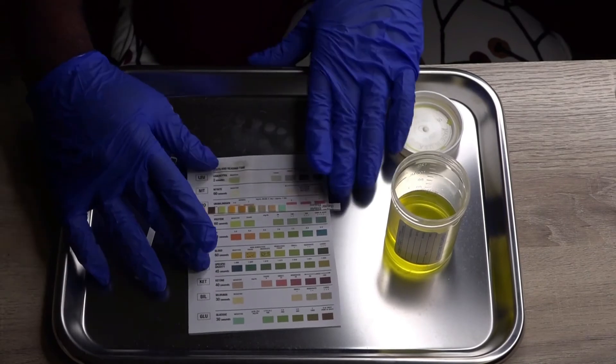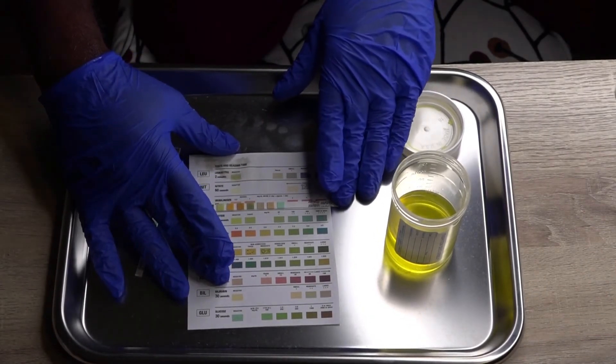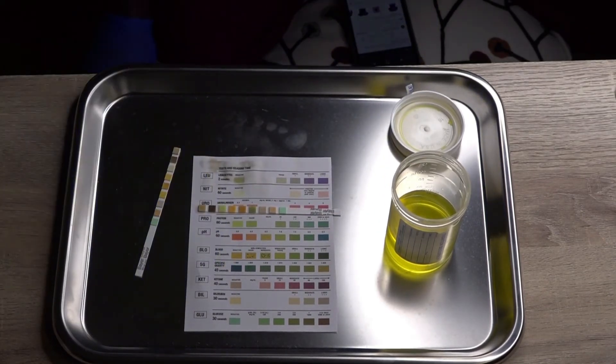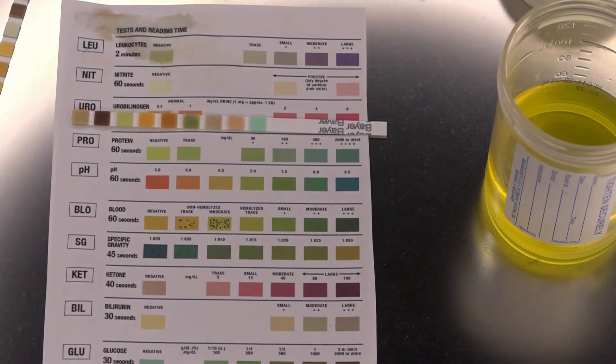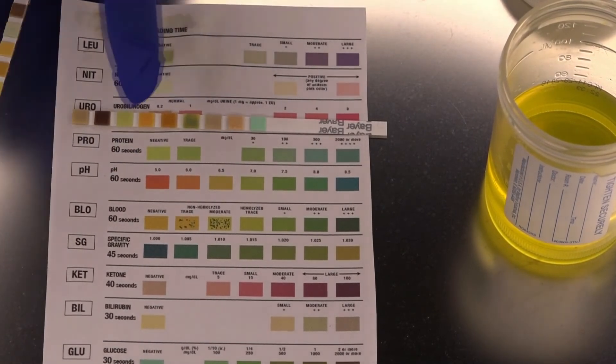So it has been a minute now. We are going to take our test strips and we are going to match it with our color key. The simulated urine that I have today actually has protein in it, and so as we look at our color guide, I am going to match it with the protein, and as I match it with the protein, you can tell by the color that it shows positive traces of the protein.